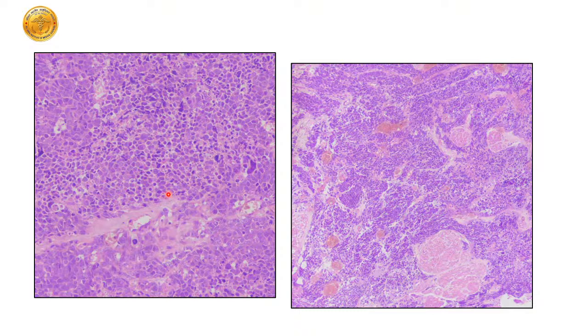The markers for neuroendocrine differentiation did not help, but on the histology also, we got a tumor, and as you can see, it's a very cellular neoplasm, with cells with high NC ratio, even at this power, which is pixelating, and extensive necrosis in between a few ectatic capillaries here and there, right? What else would you call it? What would you call it, let's say, if you were seeing this from the lung?